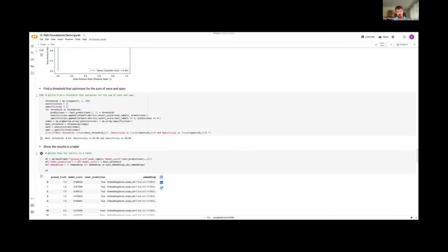So when they do whole slide imaging, occasionally you have low quality images. And that's a problem because you don't know necessarily at the time it's been scanned, and you have to go back and actually fix it. But some of our collaborators are interested in actually just running this model on that to see, is there a high quality focus on this image? And if it's not, flagging that at the time of scanning so that they can go back and fix that and rescan it as required.